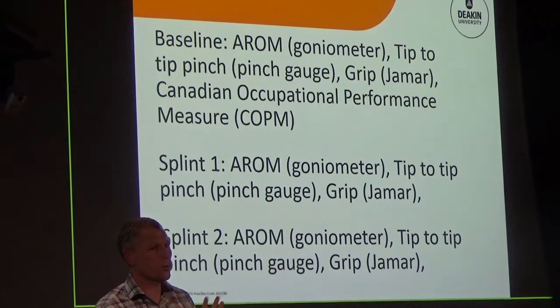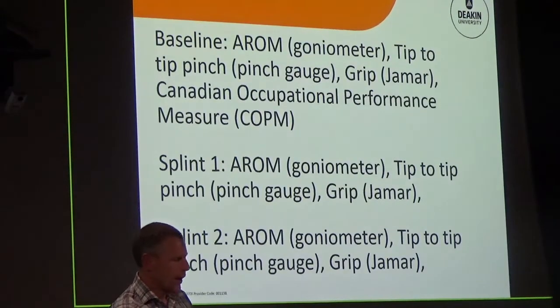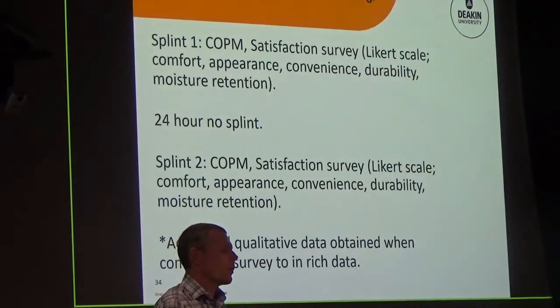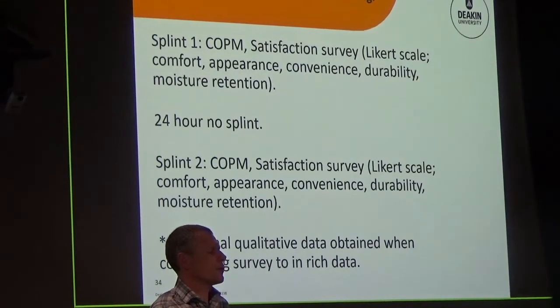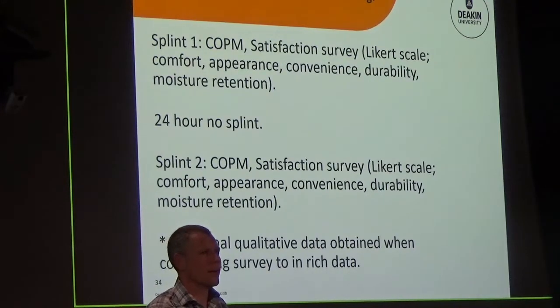So we had all this direct comparison between baseline, their first splint, whatever they were randomly allocated to, and then they took that one off and put their other splint on, got the same measurements, all done within that first session. At the 24-hour mark they were called up via phone and they completed the COPM and the satisfaction surveys in a Likert scale, looking at some questions. And as I mentioned before, they had 24 hours off and then they put on whatever their other splint was that they were randomly allocated to.